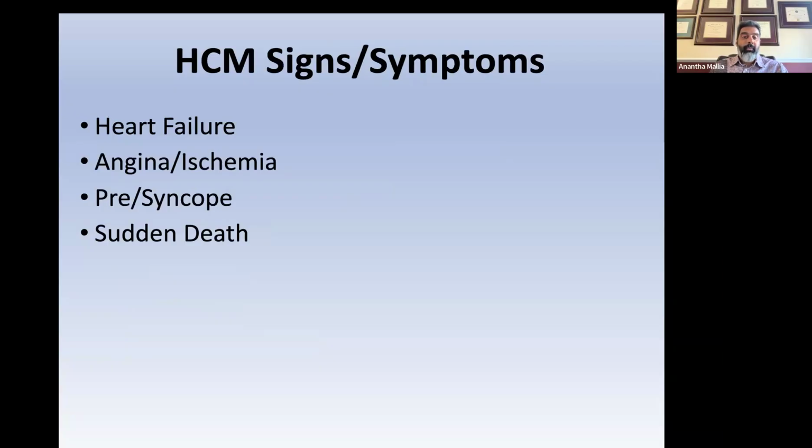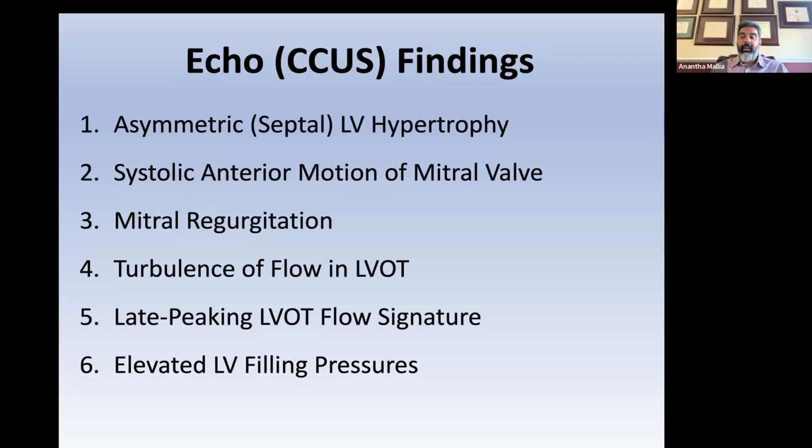As you know, if you're lucky and have HCM, you'd present with heart failure, or with angina, or with syncope. And of course, if you're unlucky, you present with sudden cardiac death. But we're here more to talk about the echocardiographic findings in HCM.